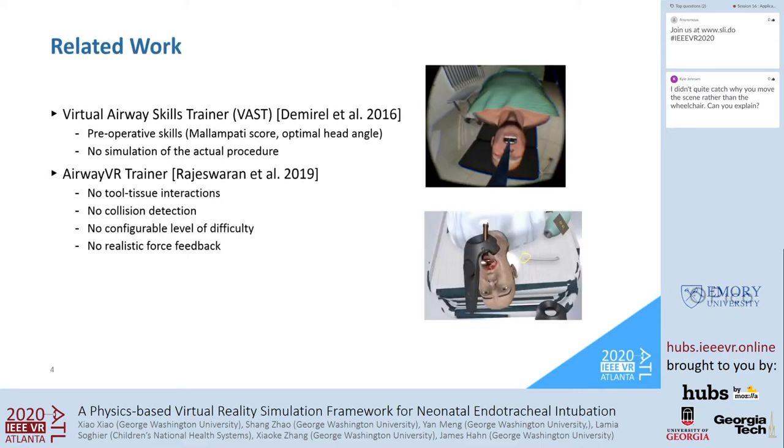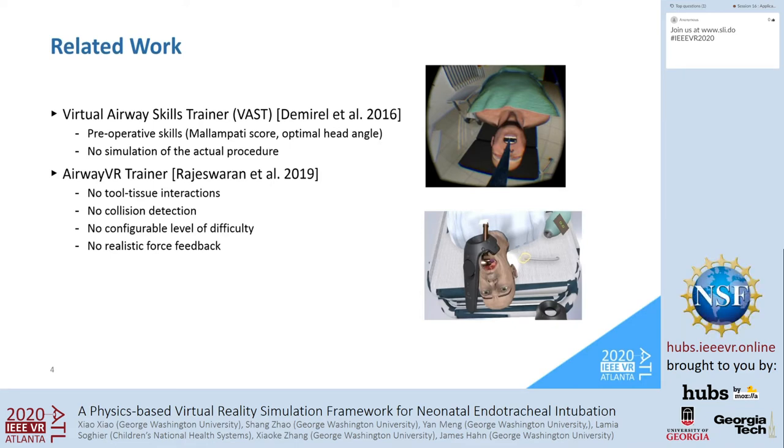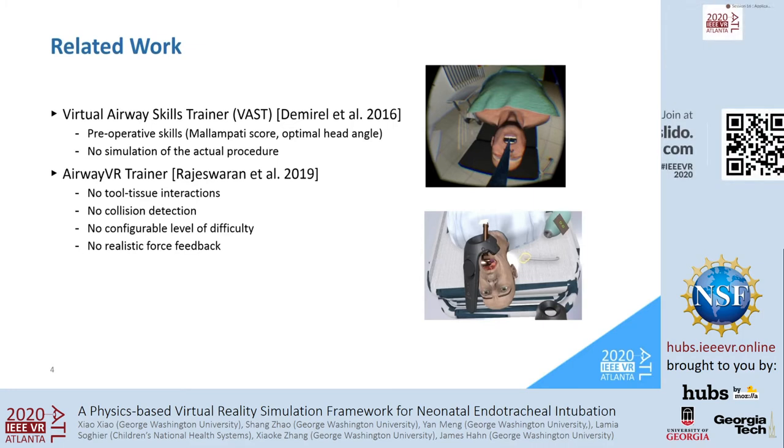In order to address the concerns of previous training methods, a few computer-based training systems have been developed, such as the Virtual Airway Skills Trainer and the Airway VR Trainer. Both of them provide realistic immersive virtual environments and allow early learning for medical students. However, they are not capable of simulating the entire procedure in a realistic manner.